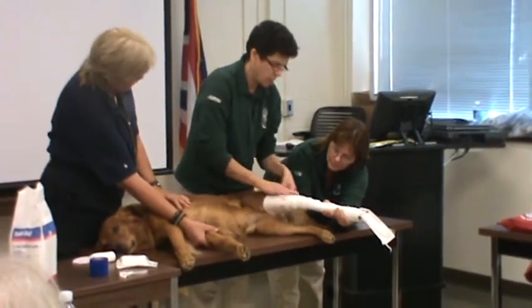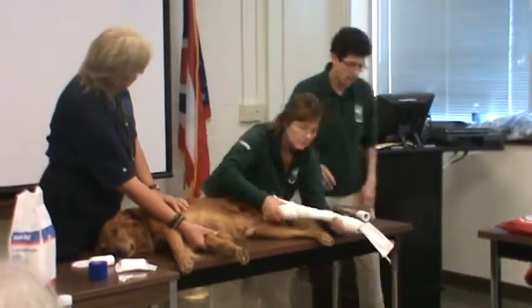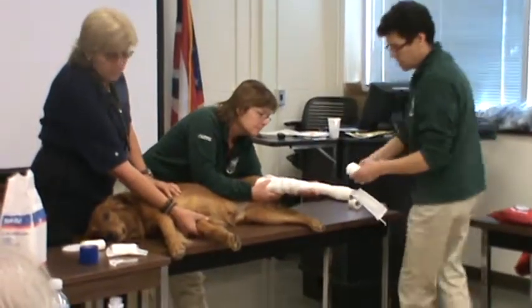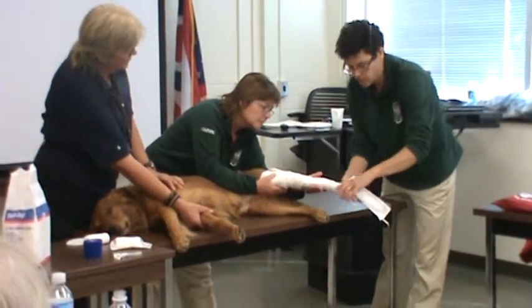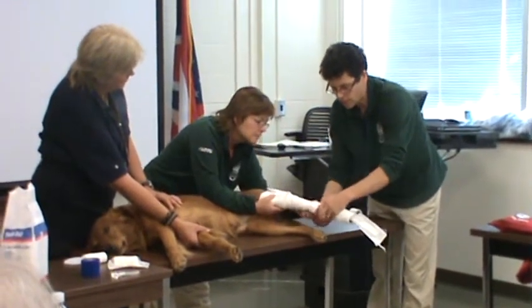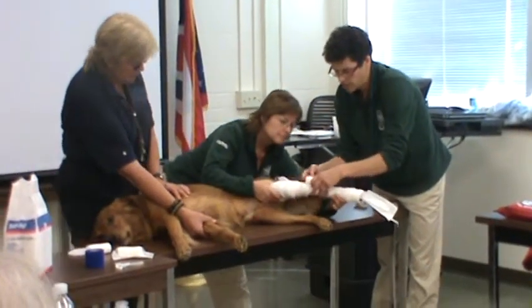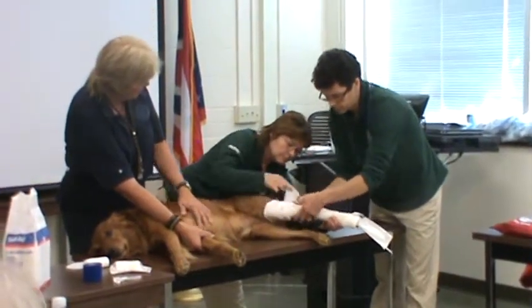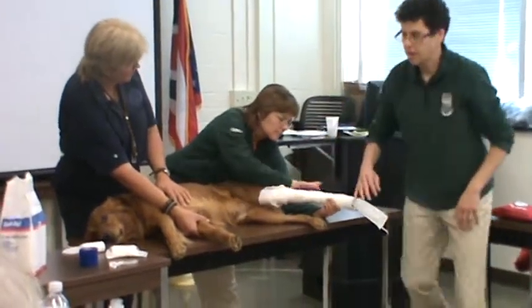In a real scenario I would probably put a couple of layers of this cotton on. I'm still going to put another layer of cotton on here, because see how it's going to cone down? I'm going to try and build up the lower part so it's just a little bit less likely to telescope down. I want to make sure the area of our injury or wound is well covered. We don't want to incorporate the tail. So we've got this built up a little bit more than that thicker area.